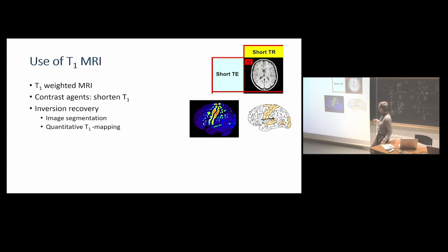So this shows basically where the myelin should reside, and these are actual measurements of the T1 time in the brain of several subjects which have been averaged. And you see that where we expect the myelin to be thick, so a lot of very well insulated axonal connections in your brain, then T1, actually these are R1 images, it's high. Yeah? So R1 is just the inverse of T1, and we use them typically interchangeably.